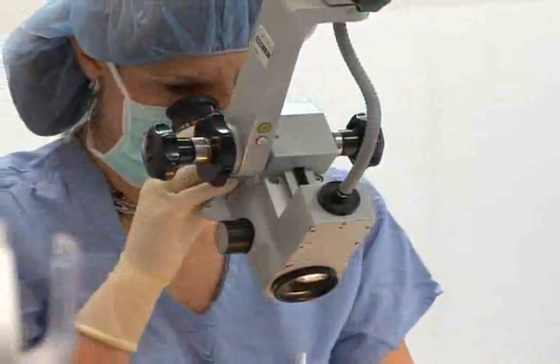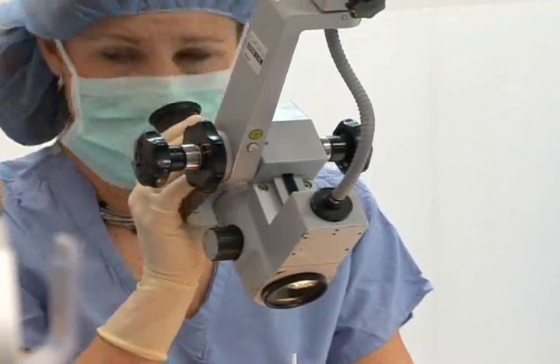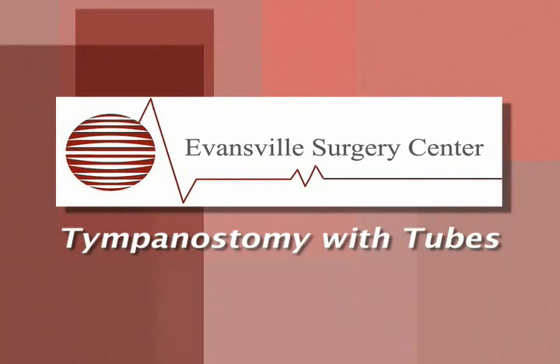Then drops are placed and a cotton ball is placed, and that ear is complete. This whole process really takes approximately 5 to 10 minutes, depending on how much wax or other debris may need to be removed from the ear canal prior to placing the tubes.